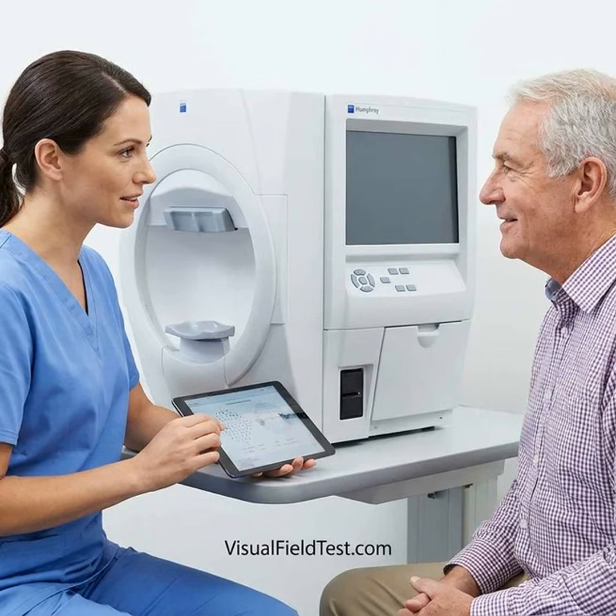A technician can immediately correct head position, distance from the instrument, use of the corrective lens, eyelid obstruction, fixation problems, incorrect button responses, signs of fatigue or distress. Traditional instruments such as the Humphrey Field Analyzer and Octopus Perimeter generally require oversight by experienced personnel.